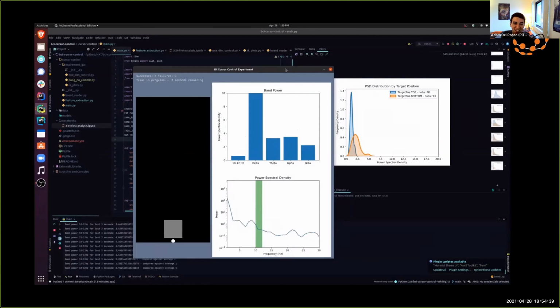And this actually is one of the bugs that I had in the system. This only happens once, fortunately, where the cursor only updates a few times per second, and it skipped right over the target. But this is a log scale over here, but hopefully you can see that we are getting the higher levels when the cursor is moving downwards and I'm relaxing.